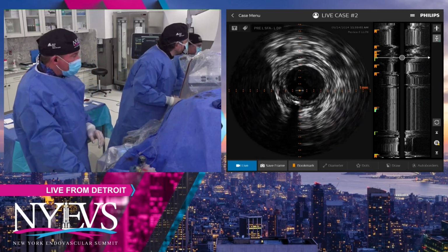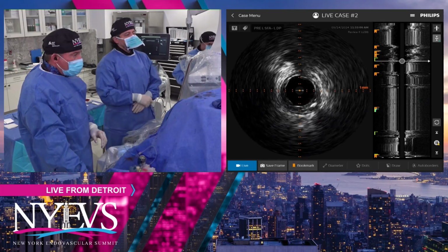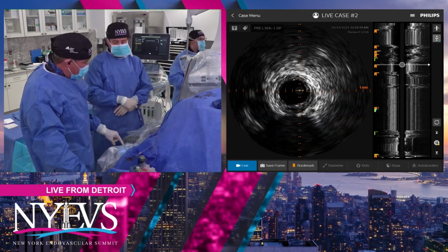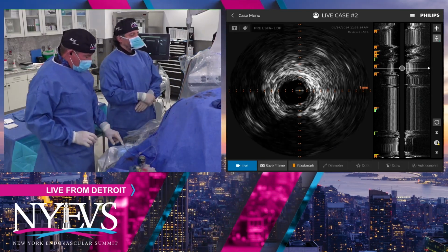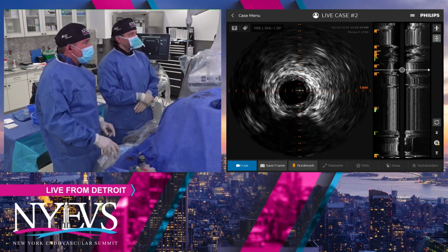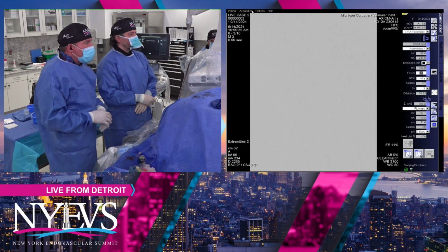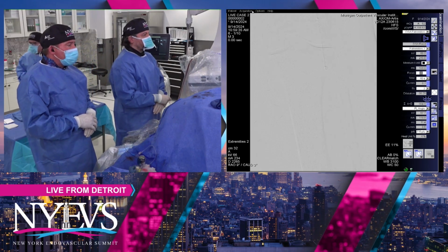We're not bleeding anymore. Are you referring to the potential hematoma or a prior aneurysm? Is that what you're concerned about with the AT? Yeah, yeah. Can we show it angiographically? I mean, I don't see anything on that imaging that would suggest that it should be treated any other way. Whatever it was, if it was from a prior intervention, it seems like that's a resolved problem, and it wouldn't affect my decision on how to treat that.